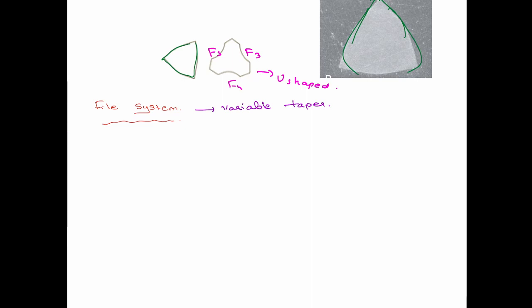or it's a progressive taper. That's why the name is ProTaper. Now remember, these were the first set of instruments to show different conicities. I'll explain this. Different conicities along the shaft of the instrument. So just finish off this lecture, because it's very important. In one instrument there were different sets of cones. That means it is basically saying that it's a progressive taper.